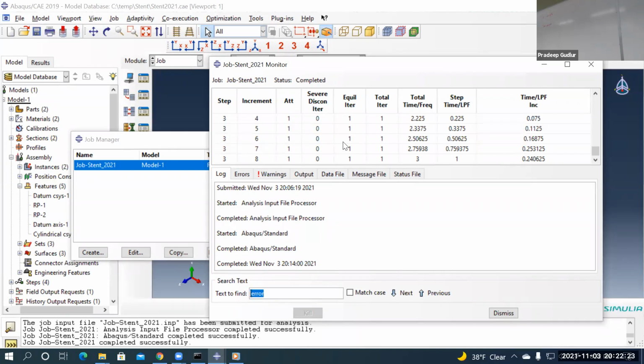That's where we are doing the animation option. And you have to move this. Step 1, now is step 2. Step 2, this should contract. Yeah, restore it. Step 2, it should contract, but it still should stay there. Step 3 is applying pressure on the surface.